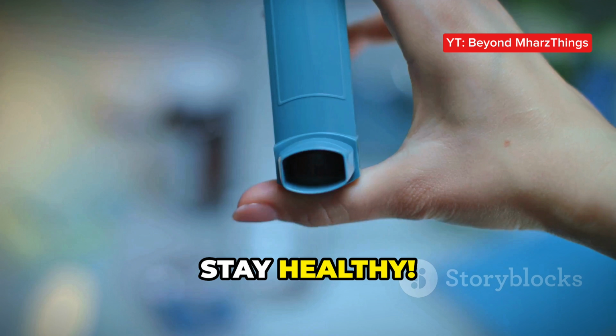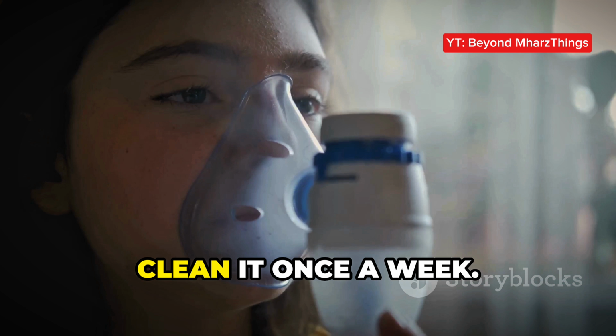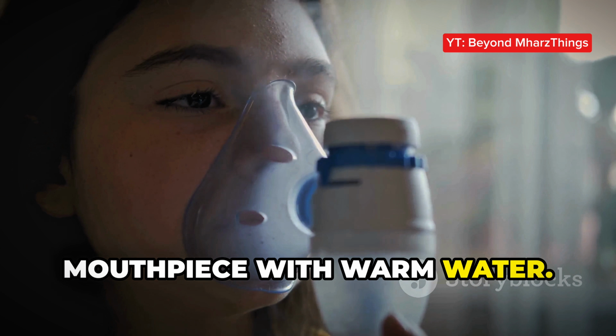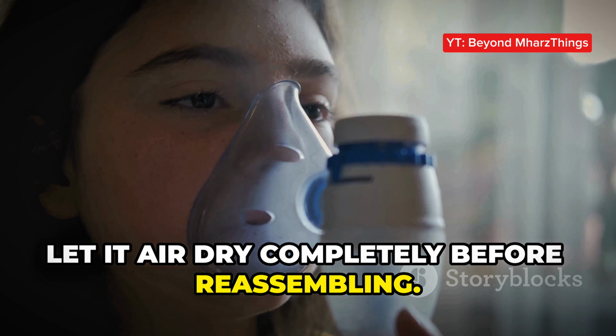Stay healthy. To keep your inhaler in top condition, clean it once a week. Remove the canister and rinse the mouthpiece with warm water. Let it air dry completely before reassembling.